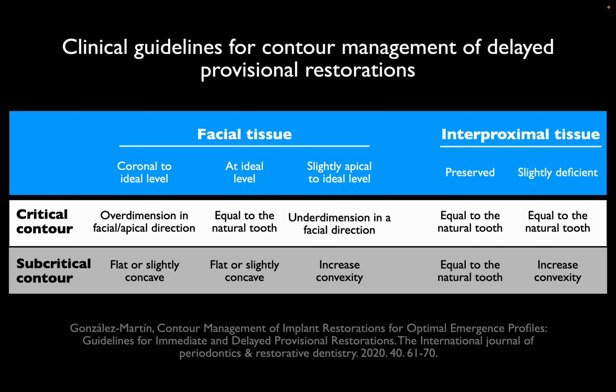From that, if the tissue were too incisal and you wanted the tooth to look longer, you want to push it more apically, then you can over contour in the critical zone. The restoration, the abutment, and the tissue will be pushed more apically. We'll discuss that with some visuals in a second.